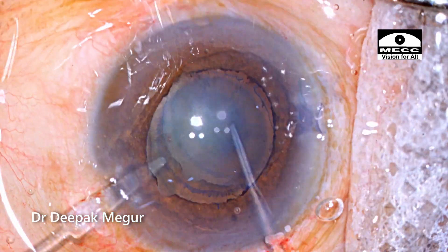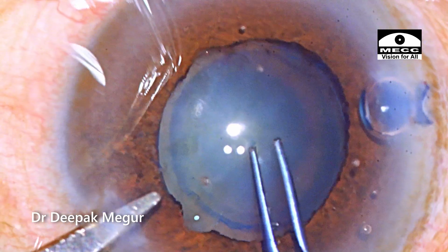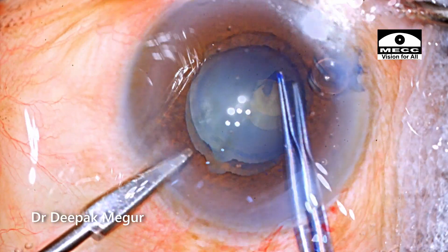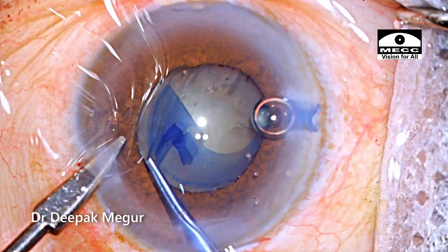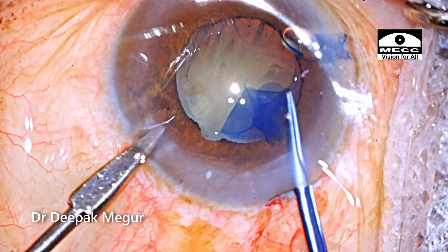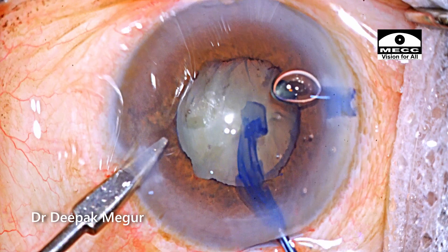Time to do the rhexis. As I'm puncturing the anterior capsule, I can see these folds in the capsule suggesting mild zonular weakness. But as I begin tearing the capsule, I'm relieved that the zonular health seems to be alright. A 5mm round rhexis is created.